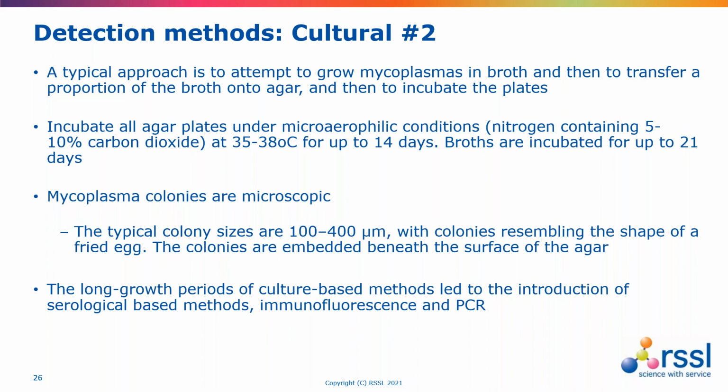So you get a feel for the limitations of the cultural technique. With some non-cultural methods, things like immunofluorescence can serve as a diagnostic tool to help with the identification of mycoplasmas in situ. And this involves DNA binding of fluorochromes and antibodies. But the best alternative non-culture based method is PCR. We'll have a look at PCR in a few minutes.